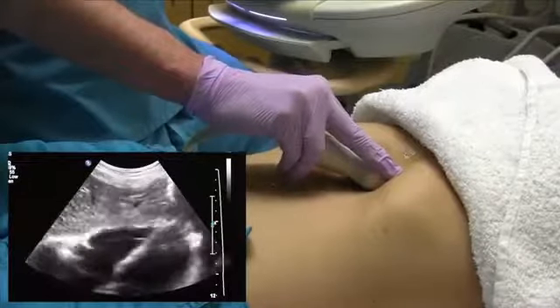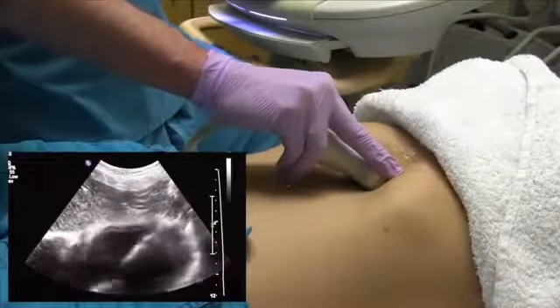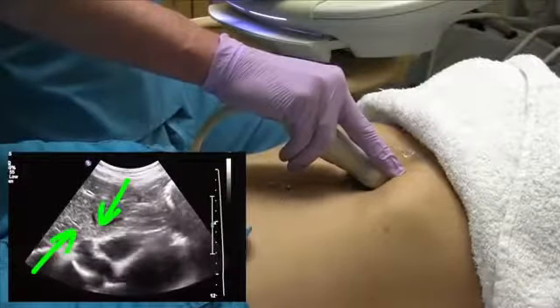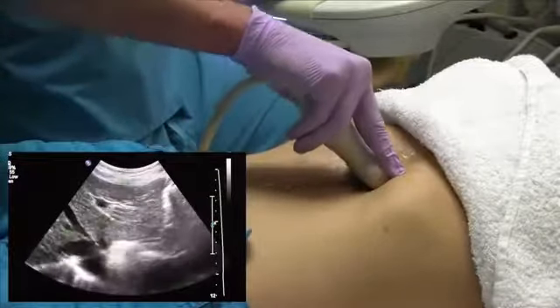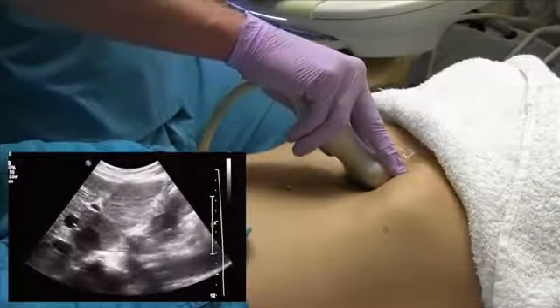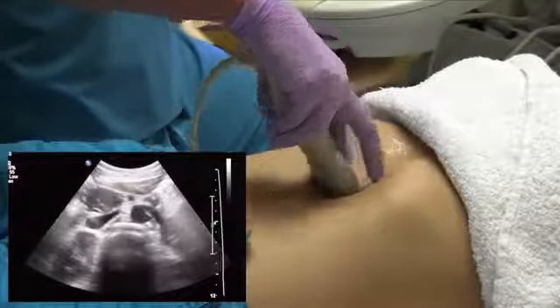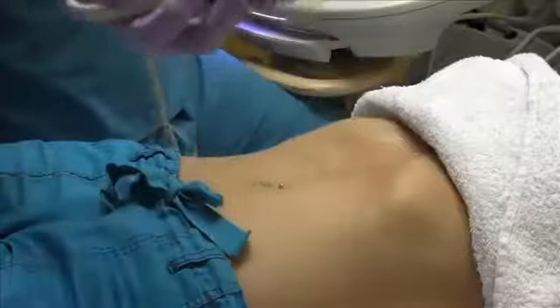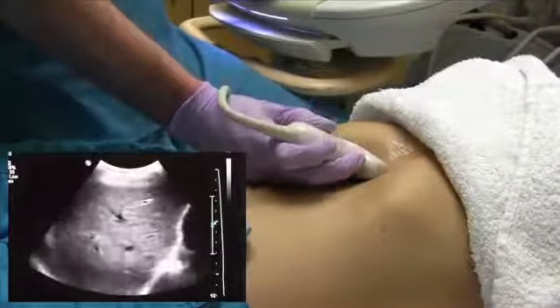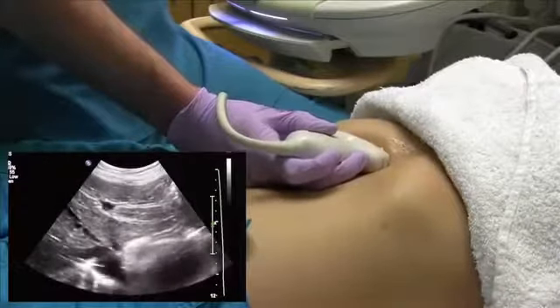You start at the top of the left lobe with the parenchyma. Coming down, you'll see the hepatic veins. And then last, you're going to see the portal veins. And you sweep all the way out of the left lobe here. You want to make sure you're sweeping through every organ, because if you don't sweep, you probably miss some anatomy and possibly some pathology too.